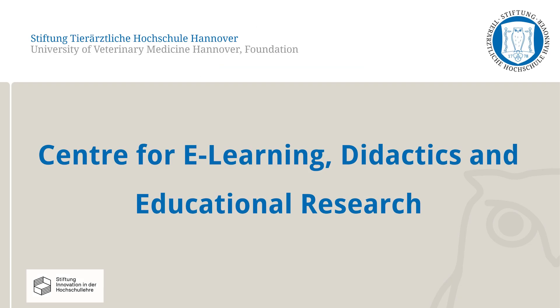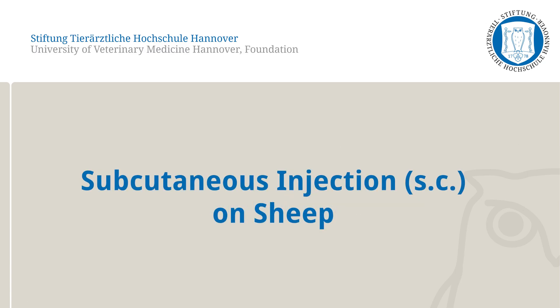In this video, the Centre for E-Learning Didactics and Educational Research at the University of Veterinary Medicine, Hanover will present how to apply a subcutaneous injection into the thorax wall of sheep. Only one of the correct methods to perform this skill will be shown here.